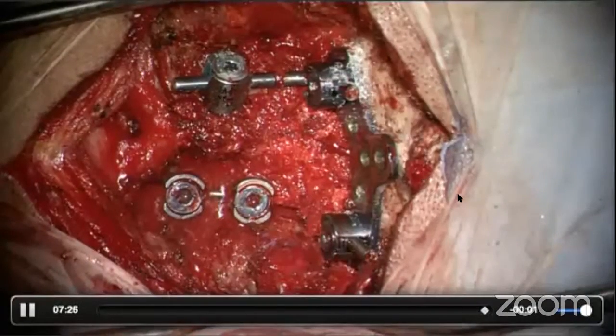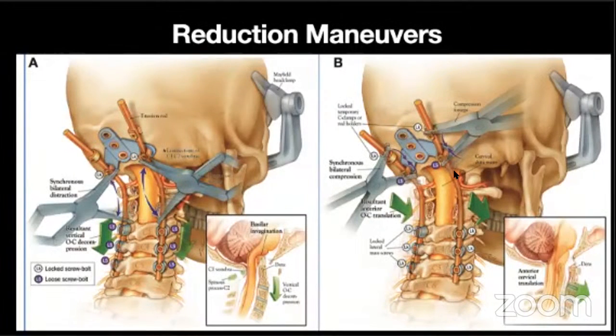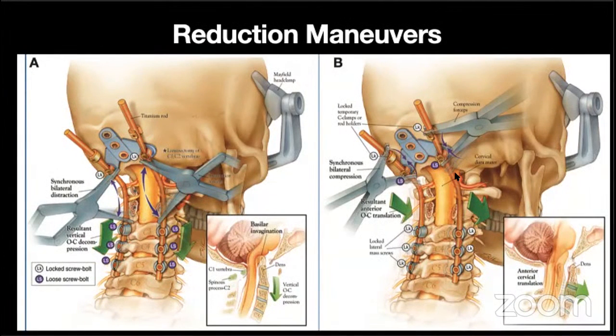That was about the surgical technique. If you want to do a reduction maneuver on those rods, you can do a compression distraction like this over those rods, or Abumi has described a technique to correct dislocations using an under-contoured rod. So all those maneuvers can be done on these rods.